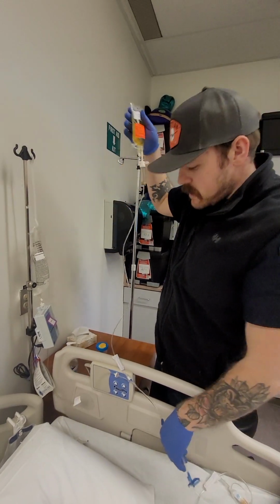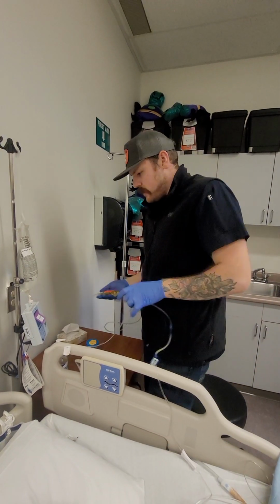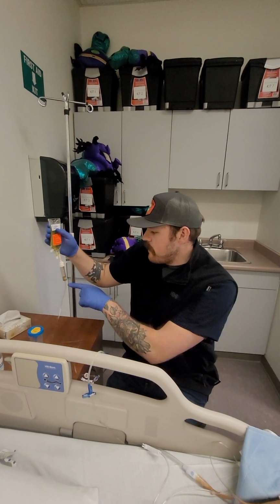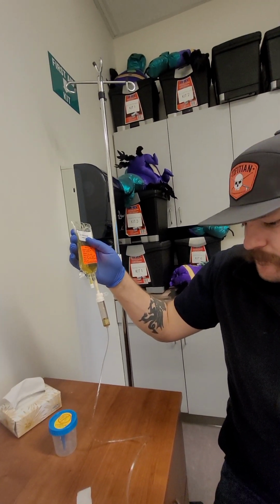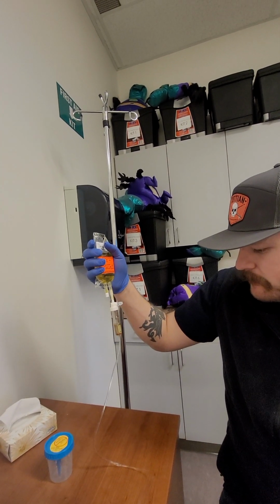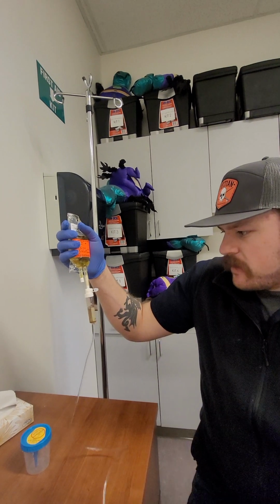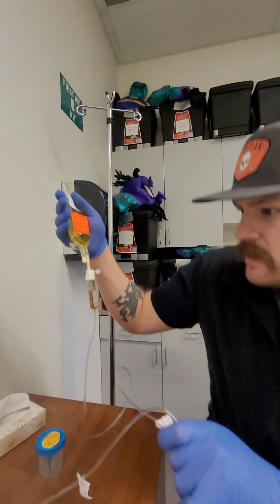So what I'm going to do is I'm going to bring the medication bag down. I'm going to ensure that the line to the patient is closed. I'm going to open this medication line. So bring that lower. We're going to see this fluid come out of the primary, and it's going to backfill this here. We're getting all our bubbles out. This is an old line, so there wouldn't be this many bubbles off the bat. Perfect, and we're going to fill the chamber to about half to 2/3 full so that we can visualize the drops.